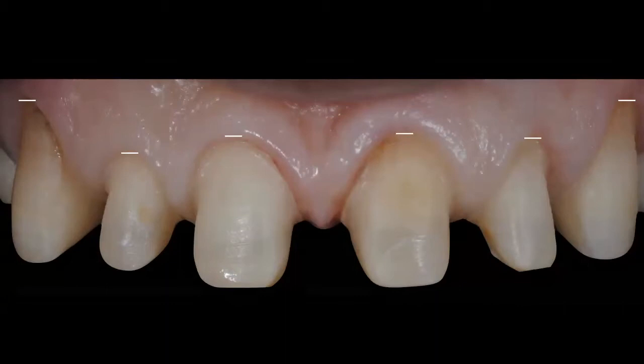If we're going to do all these restorations in a single shot, we're just going to choose one shade and send it to the lab, and the lab will fabricate all the restorations at the same time, using the same substrate and the same shade that you provided. So normally you're not going to have any issues in these cases.